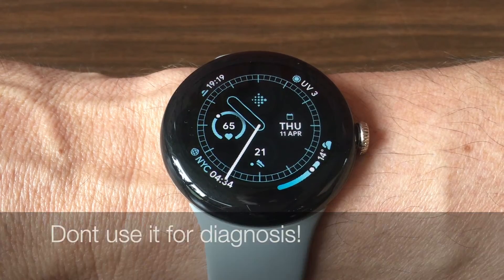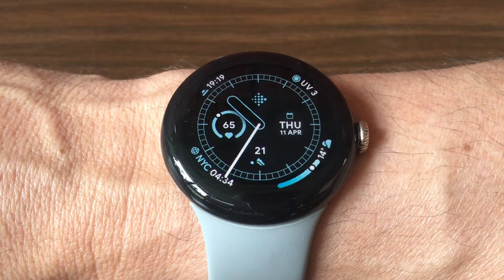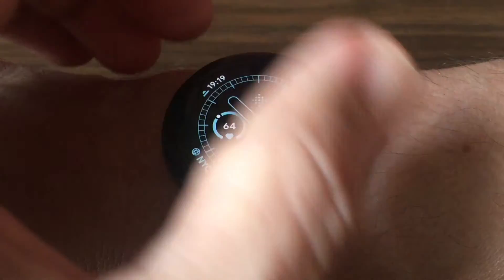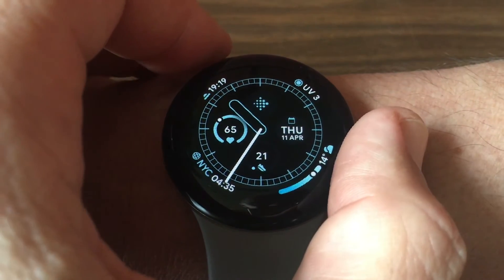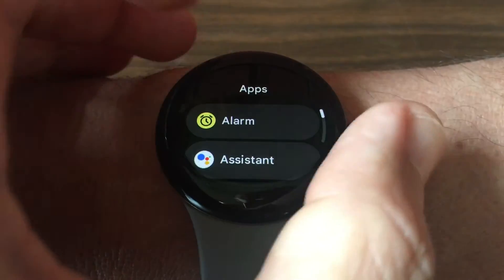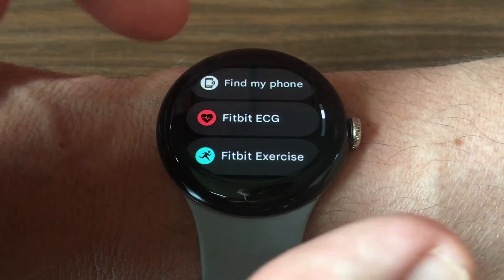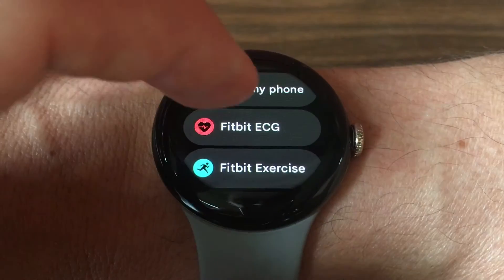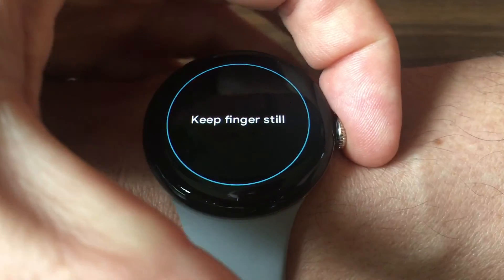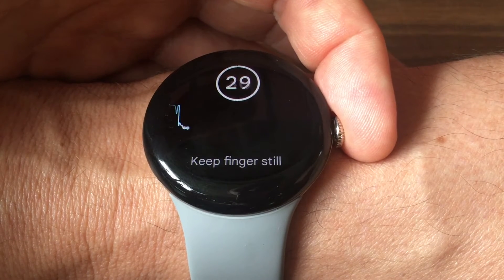To use the ECG app, I found that it was already downloaded on my Pixel Watch. Go into the list of all apps, scroll down and find 'Fit ECG', click on that, and you'll get the instructions on what you should do.